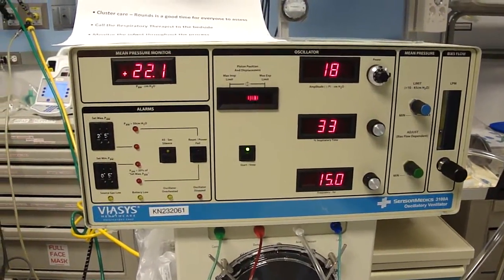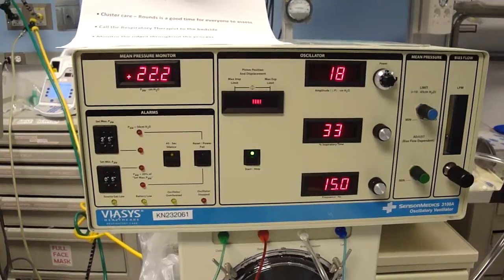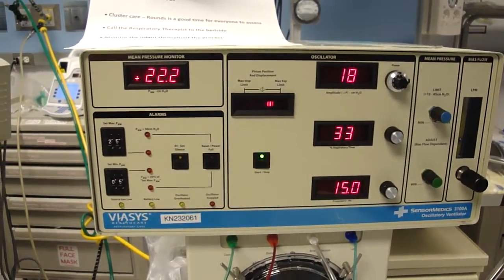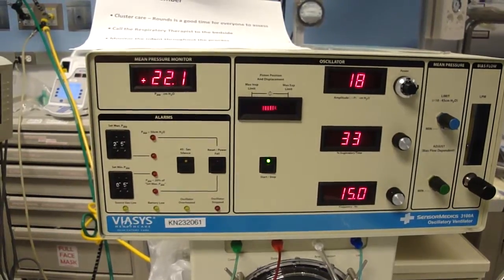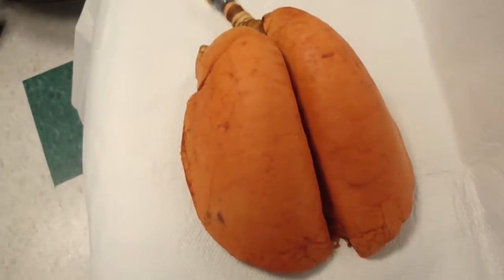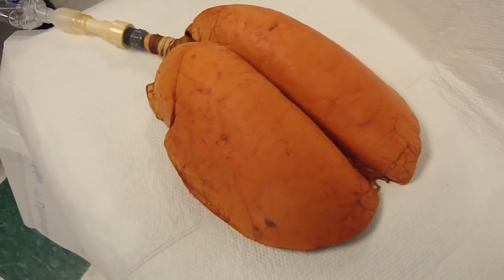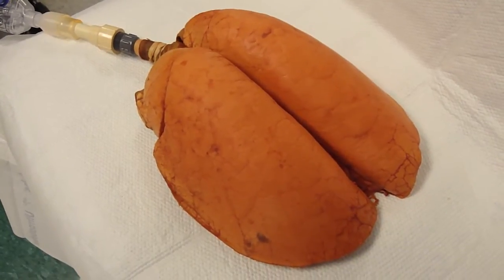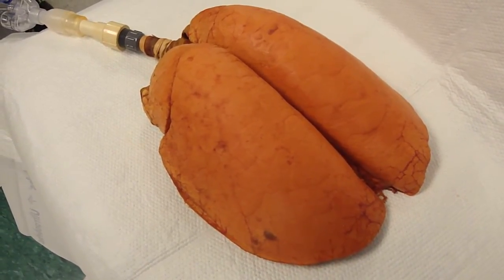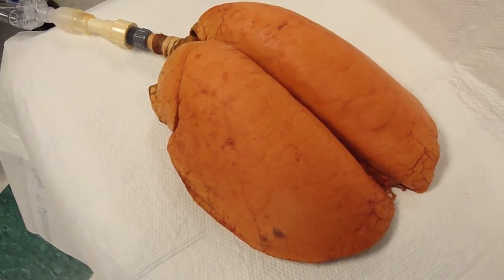When we have patients on the 3100A oscillator in the newborn center, teamwork is involved when a patient assessment needs to be performed. With the oscillator running, the lungs gently vibrate and maintain their lung volume. When it is time for patient assessment to check breath sounds, heart tones, and perhaps bowel sounds, try to cluster care so that those that need to listen are present.